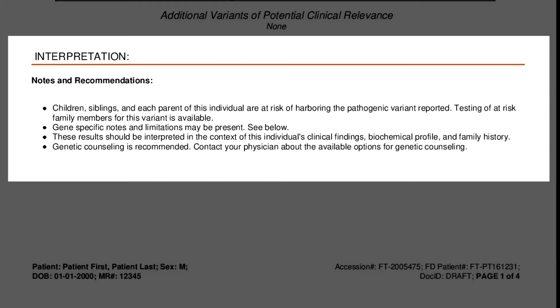We also recommend that the care providers review this information in context. At the lab, we don't always have access to detailed information about the person's medical or family history that may be relevant to interpreting the genetic results. For this case, knowing that the person had clinical signs of Alport syndrome made the interpretation very clear. If we had seen the same result in an adult with no ocular, auditory, or renal concerns, we might have come to a different conclusion.